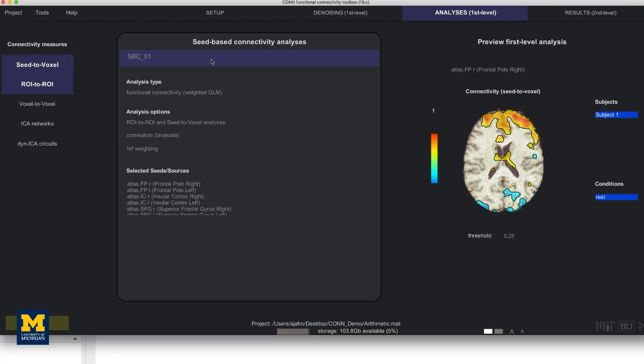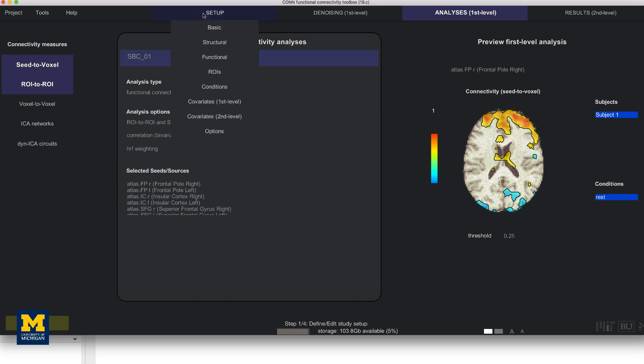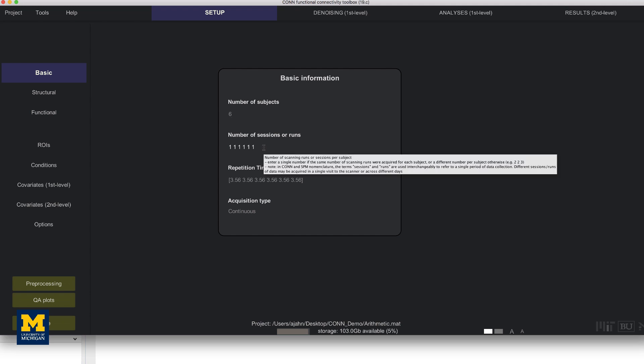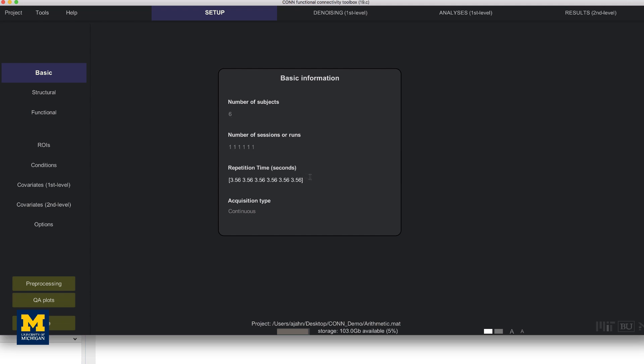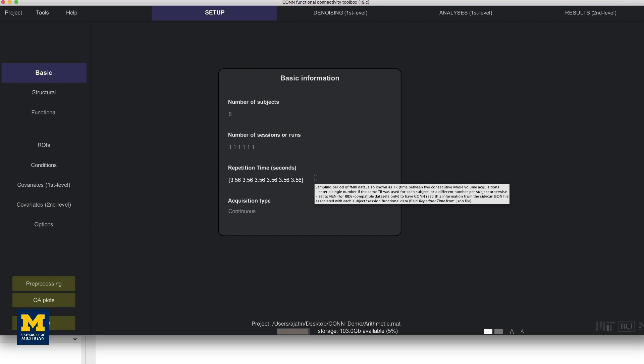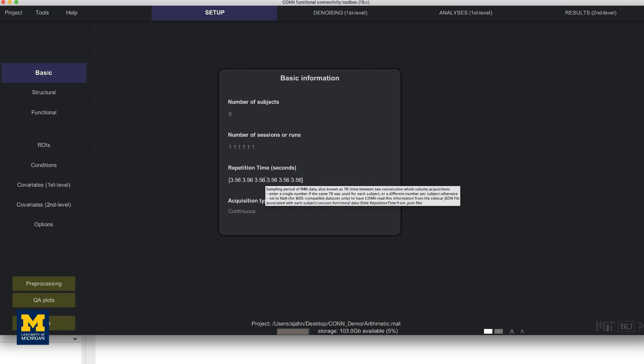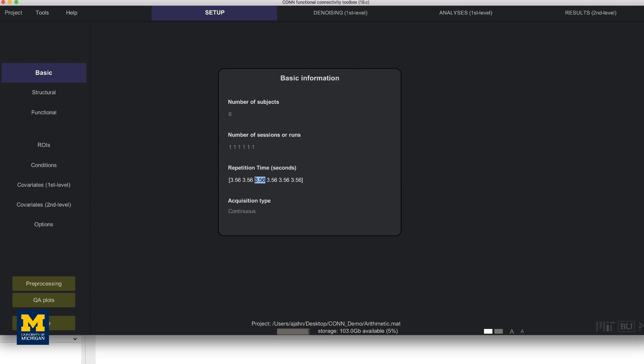Then from the CONN GUI, click on the setup tab and click basic. Change the number of subjects from one to six and observe how the number of sessions functions and the repetition time expands to reflect the total number of subjects. Each number corresponds to each subject in the dataset. For example, the third number in repetition time corresponds to the third subject that we load. If the third subject's TR was 2.5, for example, we could make an edit like this. In reality, each subject's TR was 3.56, so I'll change it back.